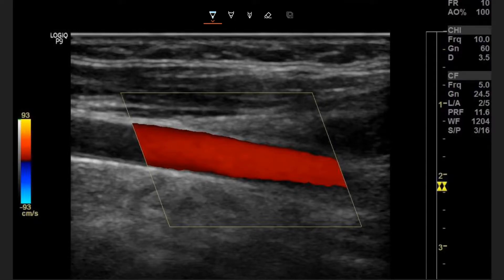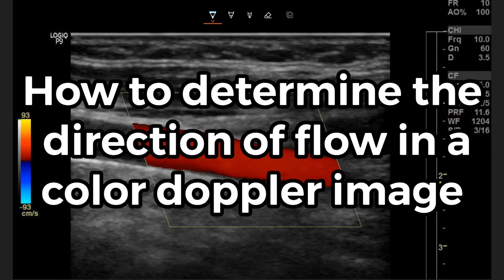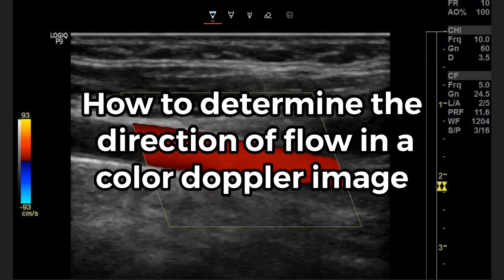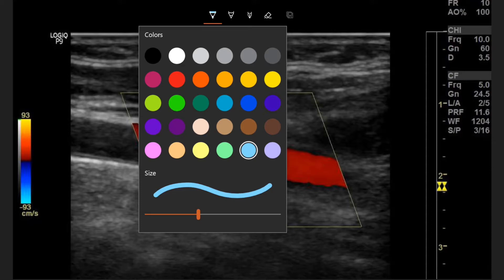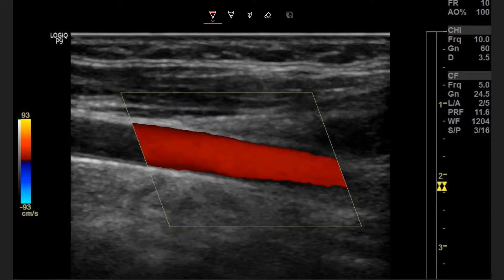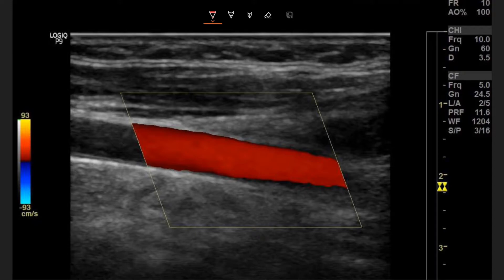Hey YouTube, today's video I'm going to teach you all how to determine the direction of flow in a color Doppler image. To determine the direction of flow, I prefer to use the home line method for the transducer. The main things we need to know are where our transducer location is and what colors are on our color map — which colors are coming towards the transducer and which are going away. These directions are the direction of flow on the screen; they are not relative to patient position.